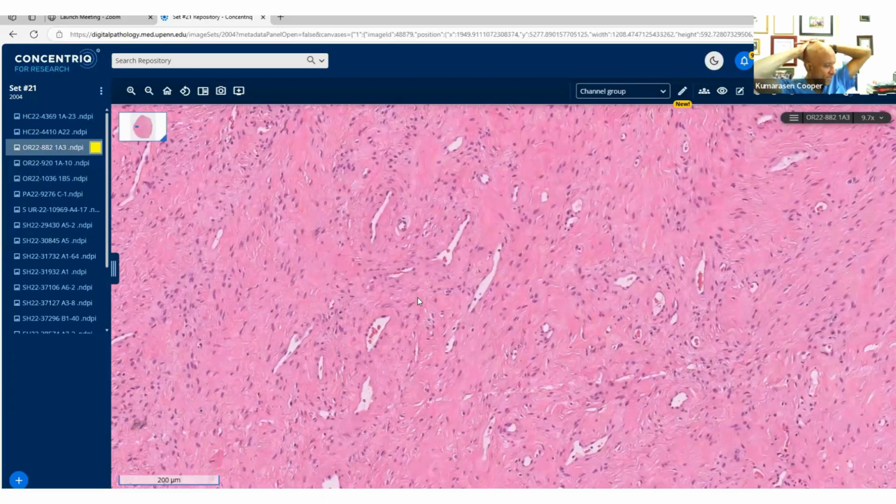And I understand in Botswana, you don't necessarily have all the immunohistochemical panel, but I would implore you, in the setting of some myxoid areas, to make sure you do the MUC4, because that adds a different dimension to the management, okay? Those are very bland, they're very benign looking. So if you could get a MUC4 into your panel, that would be really nice.